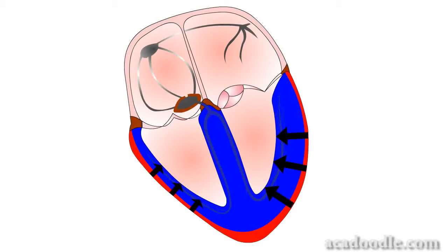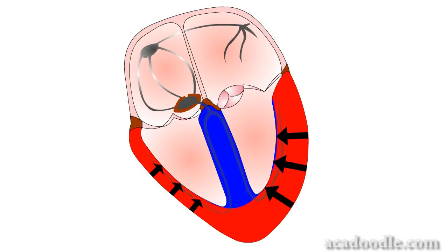Therefore, perhaps counterintuitively, repolarization spreads through the ventricles in the opposite direction to the depolarization wave. As illustrated here, following ventricular depolarization, repolarization begins in the epicardium and spreads backwards from the epicardial to the endocardial surface of the ventricles. We'll see later that this retrograde spread of ventricular repolarization is important in understanding the normal ECG readout.